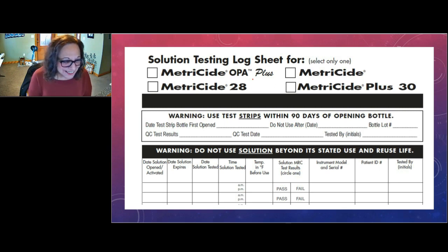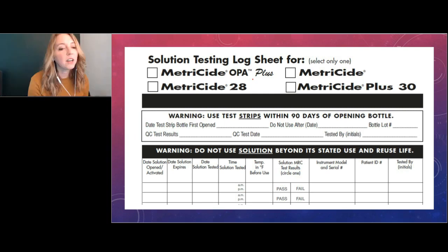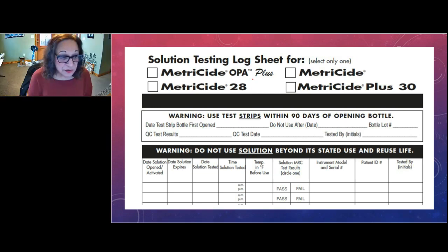That's great. This next question, sort of related to a previous one, can a cold chemical sterilant be used in an ultrasonic? No. Cold chemical sterilants are actually meant to sit still for soaking. When you put something into an ultrasonic, you are generating heat. For most ultrasonics, the tabletop models at least, you do not have a method or way to control that temperature, plus the cavitation.